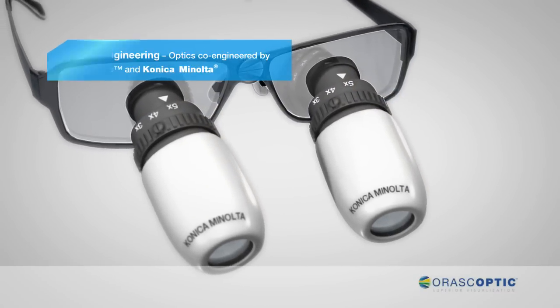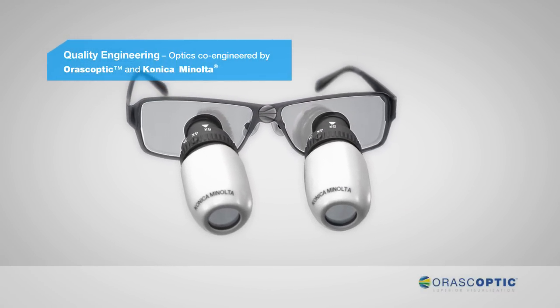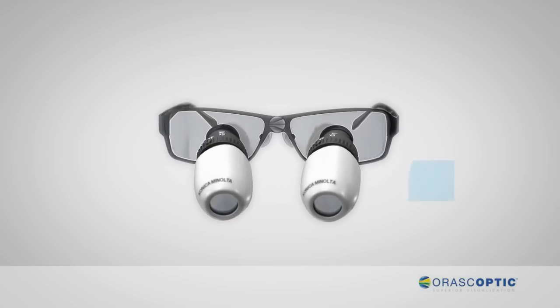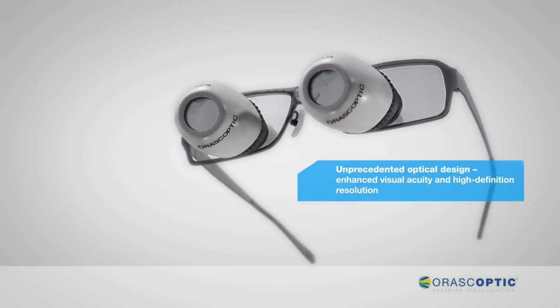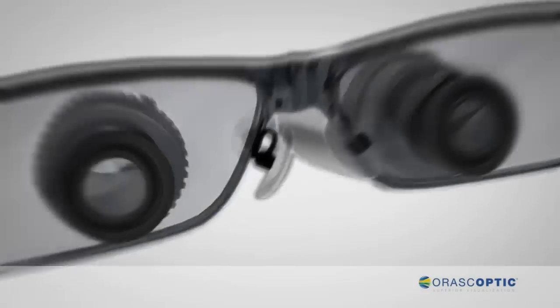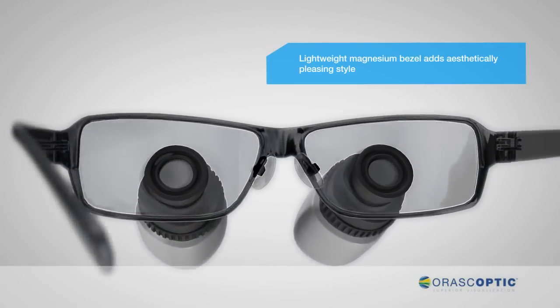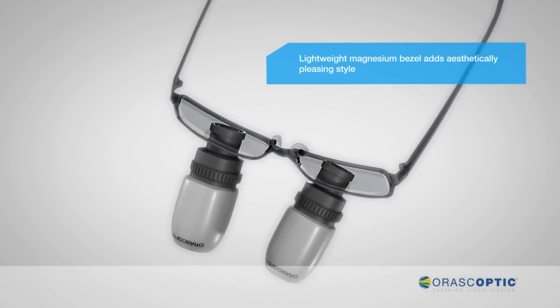The innovative optical design is co-engineered by world-renowned optical pioneers Orascoptic and Konica Minolta. This collaboration of optical experts delivers high-definition resolution and enhanced visual acuity. The lightweight magnesium bezel is designed to reduce weight and help increase comfort while adding a contemporary aesthetic to this medical device.